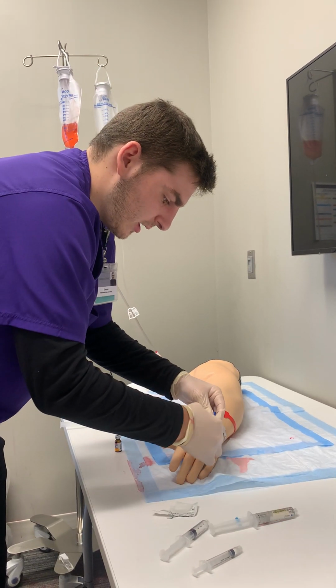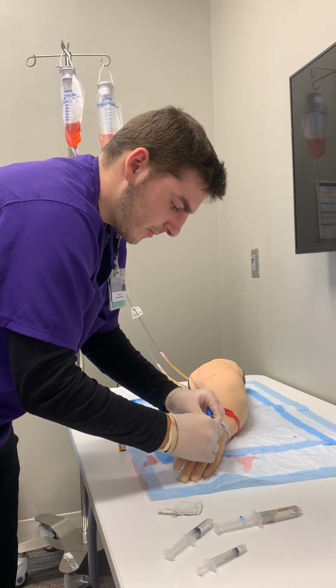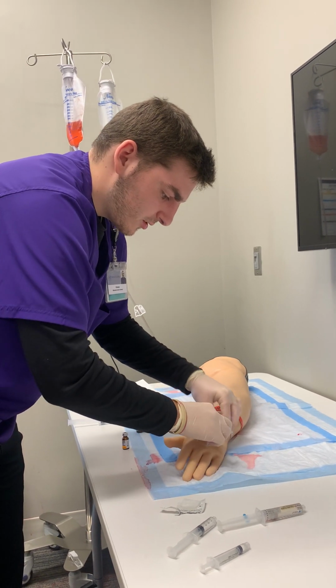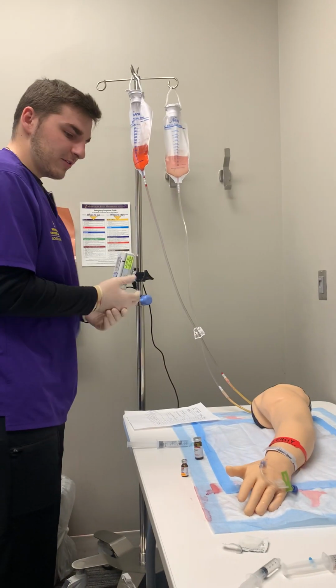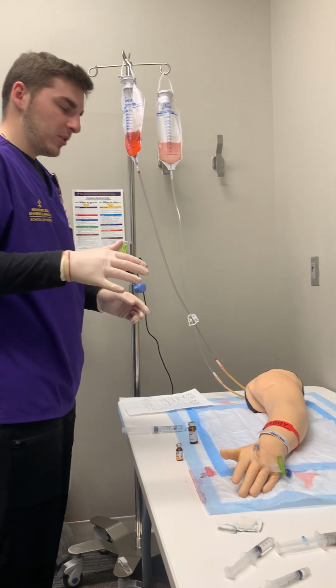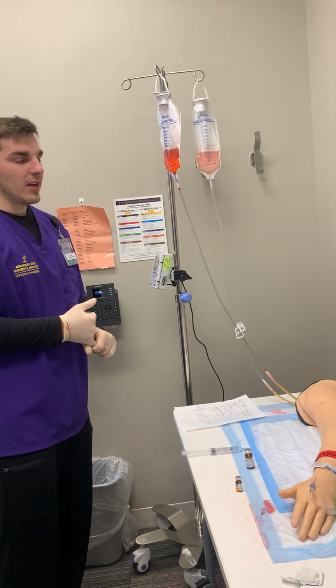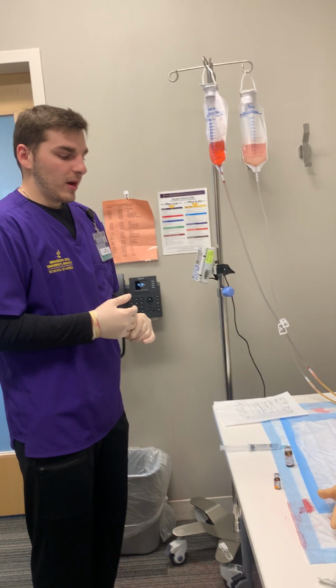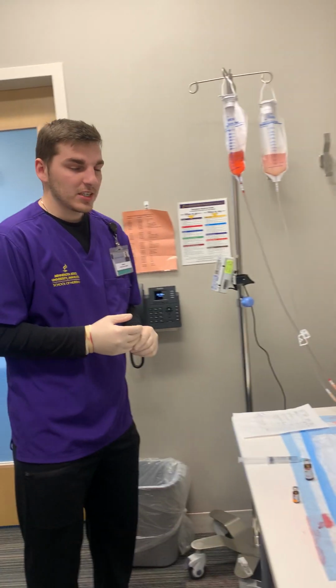And now that I'm done, I'm going to reclamp this and make sure that this is all connected. And I'm going to give you your call light, see if you need anything else. I'm going to gather my supplies and then leave you in a comfortable position and go document that I gave you your medication. And then I'm also going to contact the provider and see if we can get you a different as-needed pain medication.